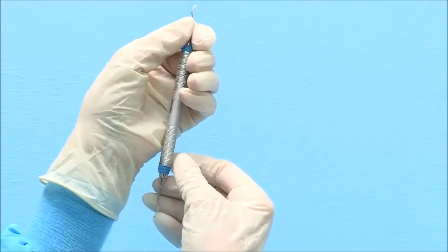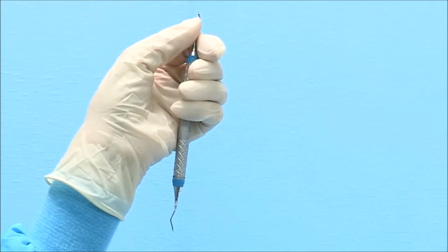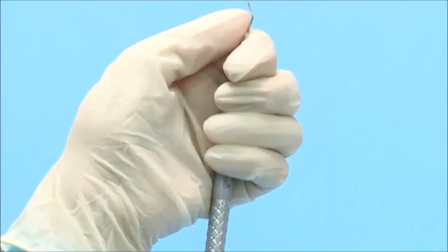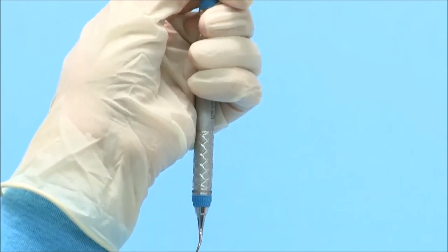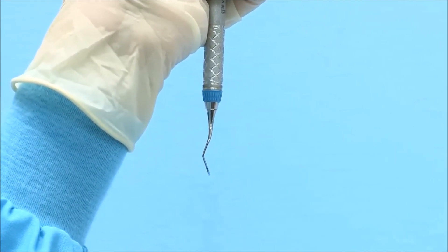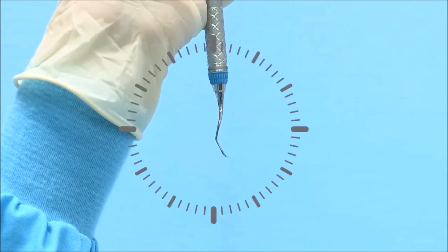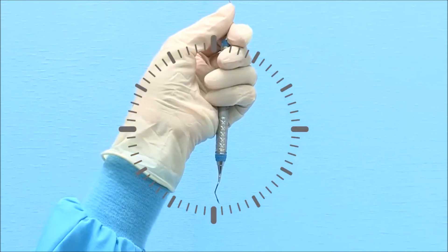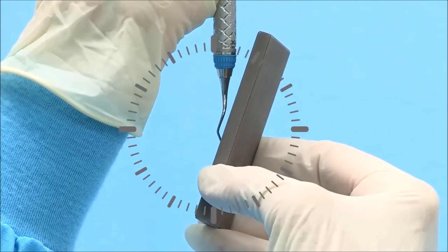To sharpen the even-numbered end of the Gracie Curette, hold the instrument vertically in your non-dominant hand with the toe pointed away from you. Use a firm palm grasp and brace the top shank of the instrument with your thumb. The cutting edge to be sharpened will be on the right side of the blade. Focus only on the terminal shank of the instrument, which is the section between the blade and the last bend in the shank. Tilt the terminal shank to 3 minutes before 12 o'clock. Position the stone against the right lateral surface at 12 o'clock and tilt the top of the stone to 3 minutes past 12 o'clock.